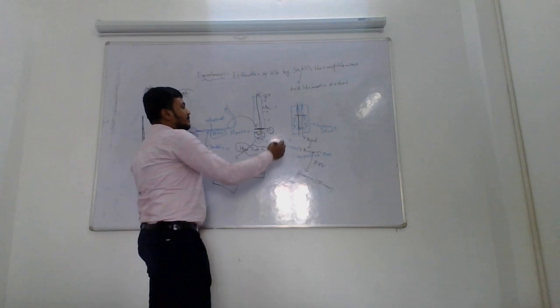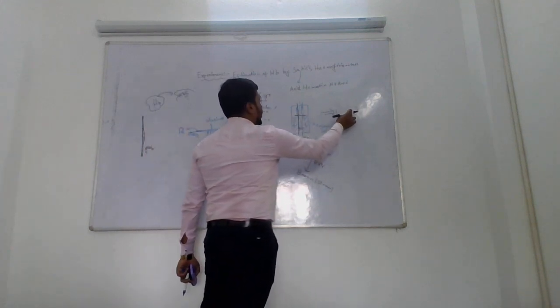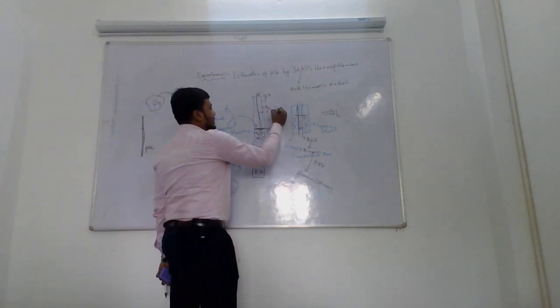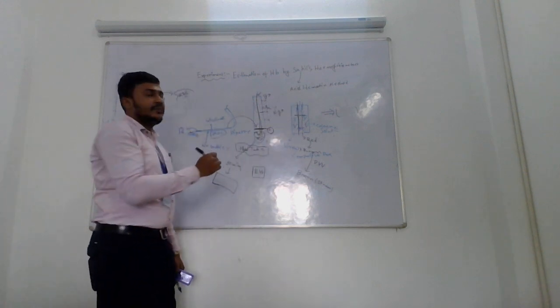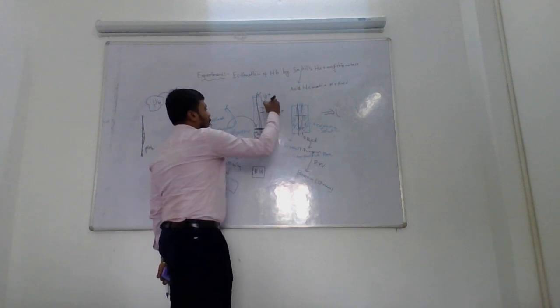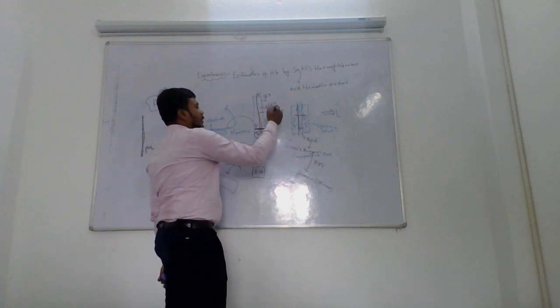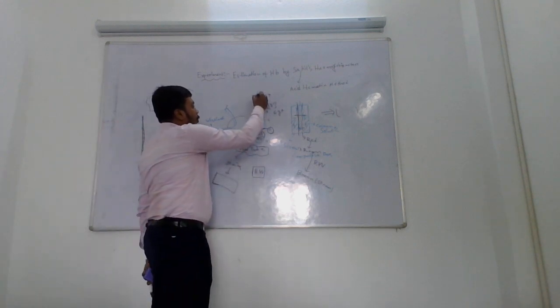Now we can estimate that this is the final value of the blood hemoglobin content. If it comes to 6, then 6 g percent is the ultimate value. If it comes to 8, then 8 is the ultimate value. For confirmation, I have to check one thing. If the result is 6, it's okay, but I have to add one more drop.